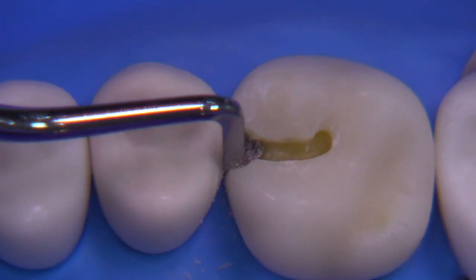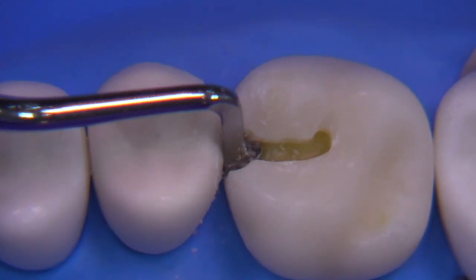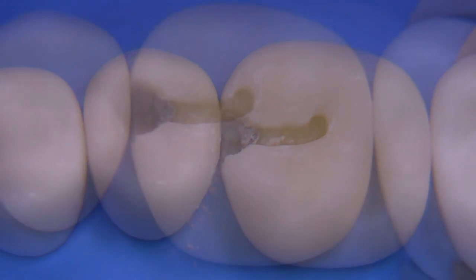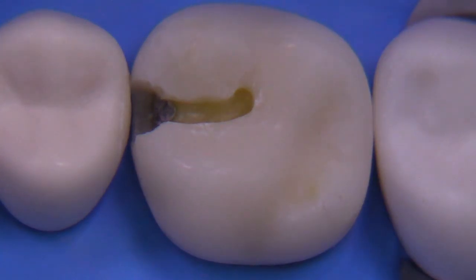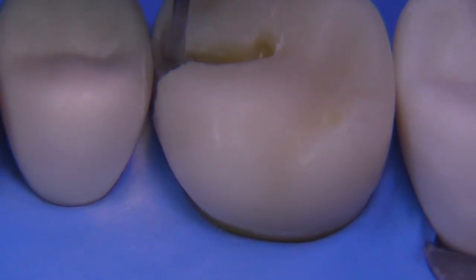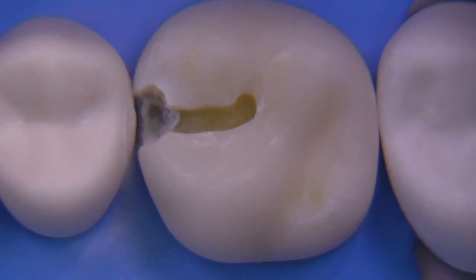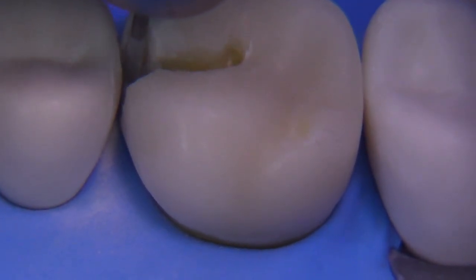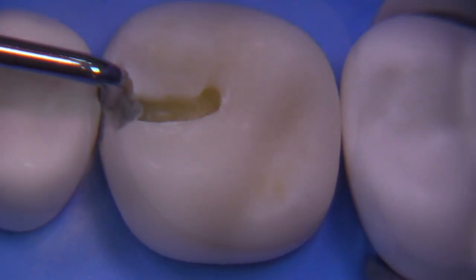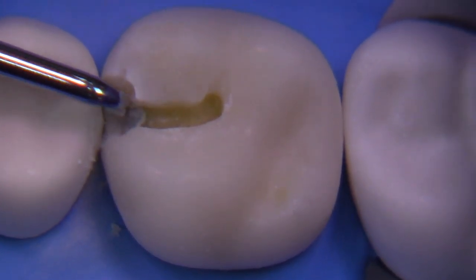About this time in the procedure I was starting to get used to the structure made by Accadental, and I think it's probably something you want to practice on before you really become familiar with the textures you're dealing with. Once again we're using the 245 to extend a little bit more facially and undermine the enamel so that we can use the hand instrument to chip it away — the undermine and chip technique — to improve your extension. The 10-714 hatchet is then used again to remove the undermined enamel that you created.